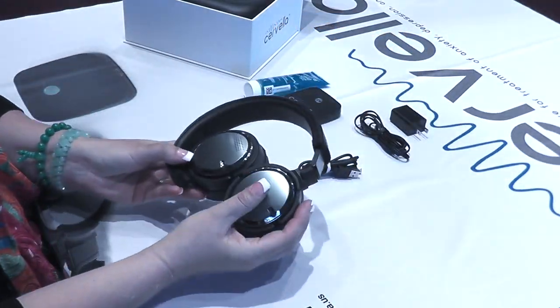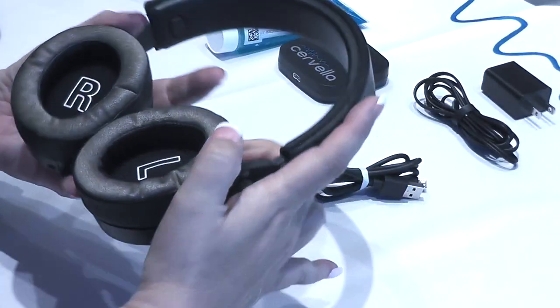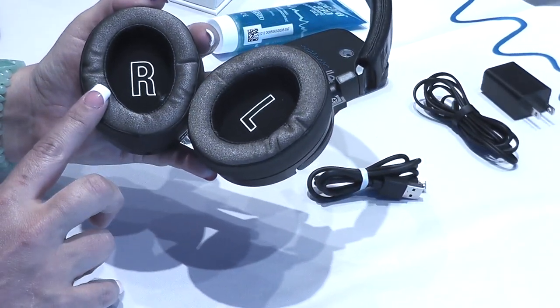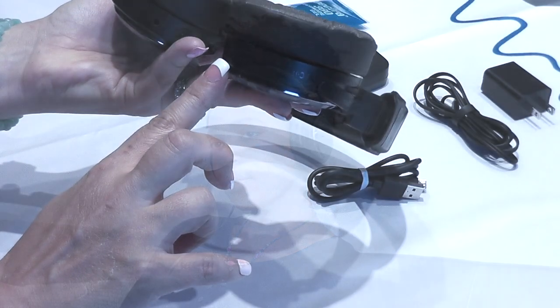This is the Cervella headset. It contains special conductive electrodes that we have integrated into the ear cushions. The headset is Bluetooth enabled so you will be able to listen to music while undergoing treatment, or even have a cell phone conversation, as it also has a built-in microphone.